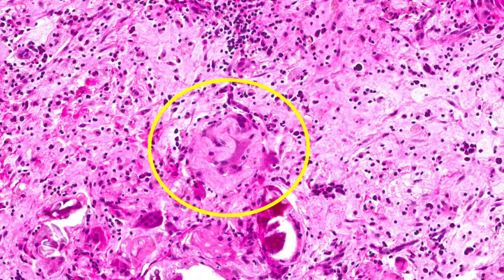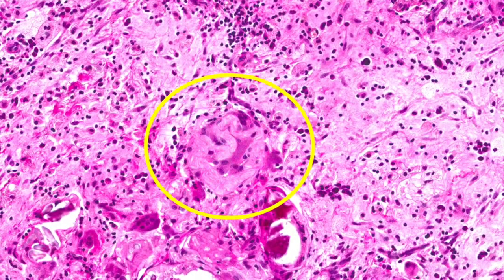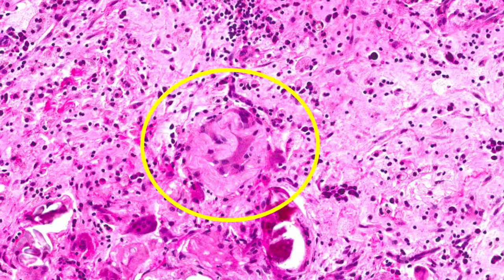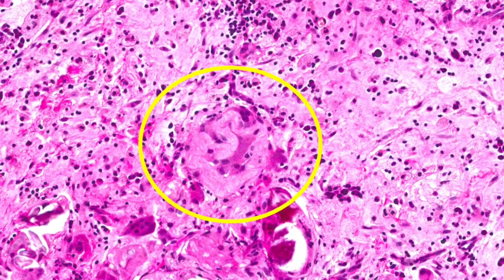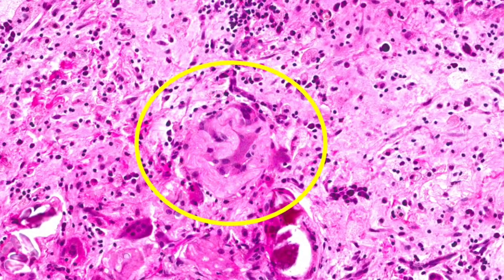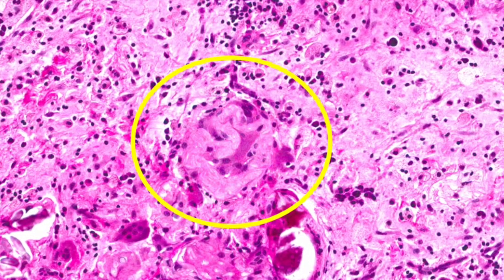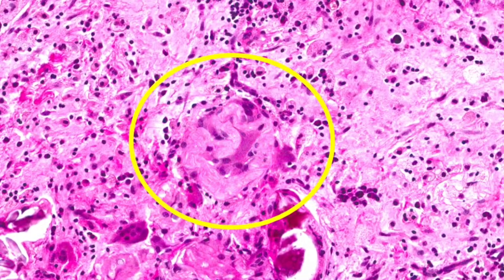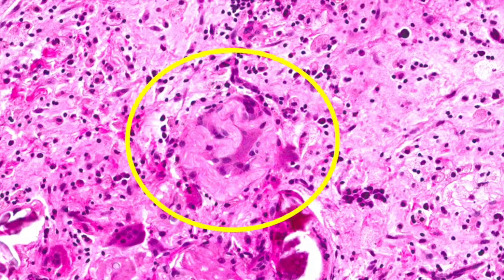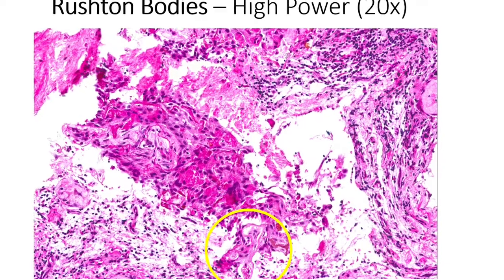Presumably, it's a reaction to food packing of plant or vegetable origin, so pulses, which is why it's called a pulse granuloma. Histologically, you can see in the circle there are multinucleate giant cells, and there's a surrounding inflammatory reaction, and it presents as an eosinophilic hyaline mass. So again, this is lending towards the inflammatory nature of paradental cysts.